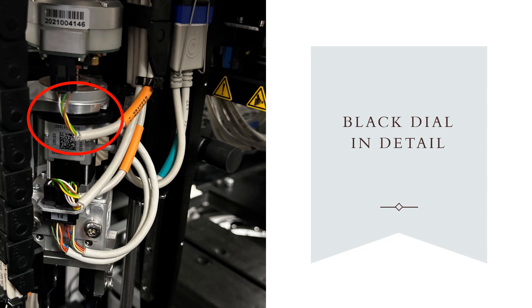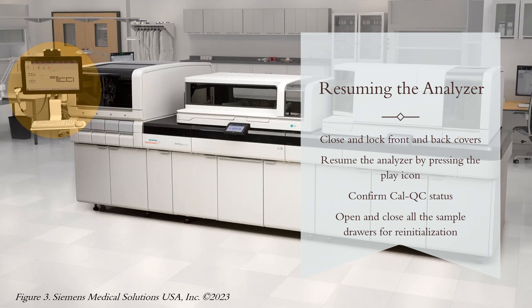One thing to note is that you do not have to retighten the gripper after taking out the tube — the analyzer will automatically adjust the gripper when you bring the analyzer back up. After we take out the sample, we're able to resume the analyzer to continue processing. The analyzer will prompt you to confirm the CalQC storage area to confirm that a technologist did not add or remove any of its contents. You can confirm that nothing was removed or added, or tell the analyzer what changes were made if any occurred.